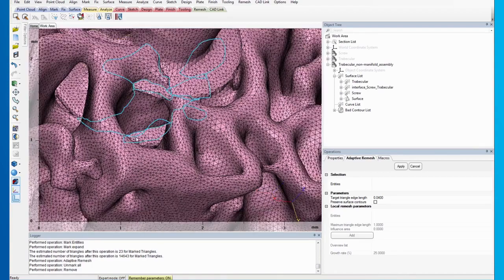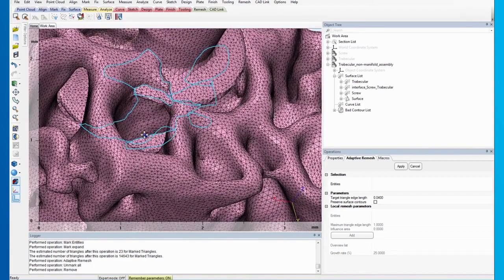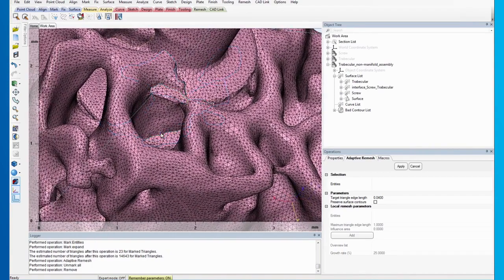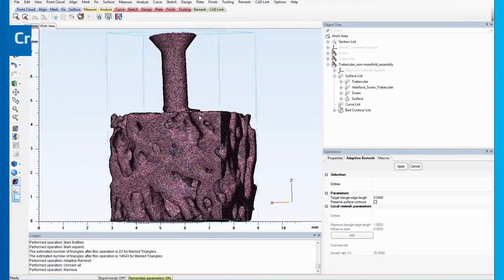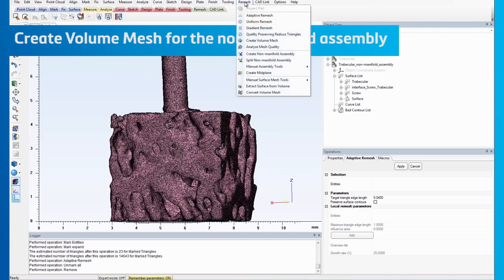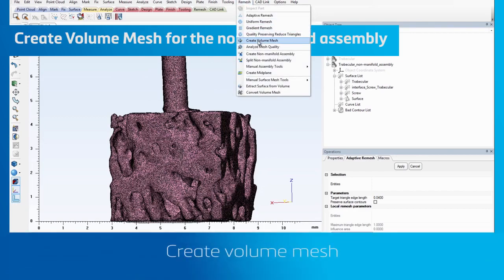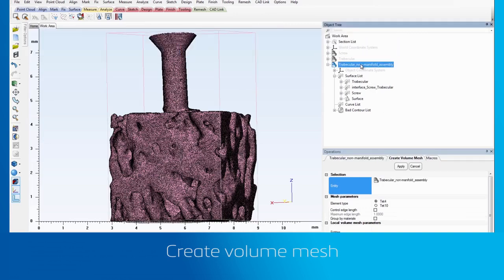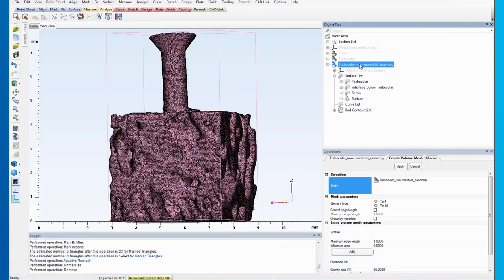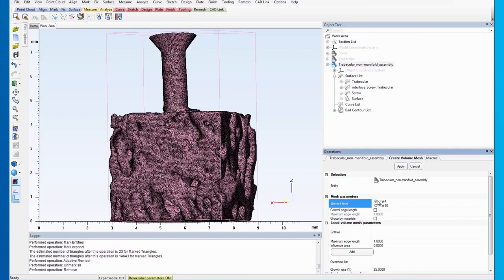Next, we will create a volume mesh for the non-manifold assembly. Go to Remesh and click on Create Volume Mesh. Then, select the non-manifold assembly as the entity. Make sure the element type is TET4 and that the control edge length is unchecked.